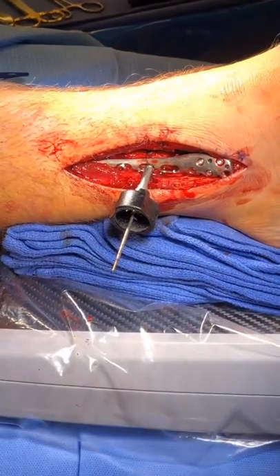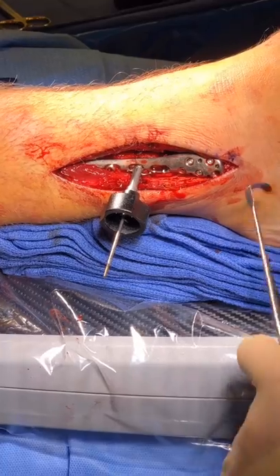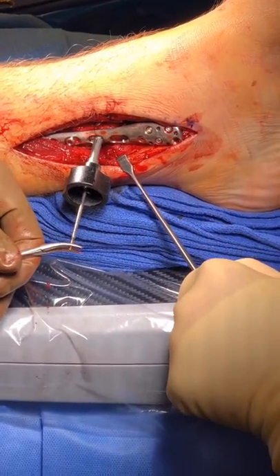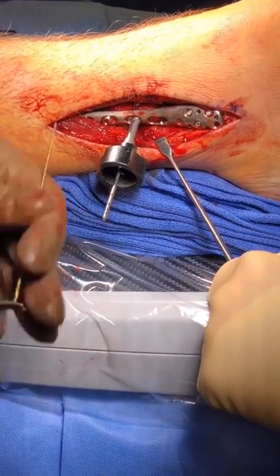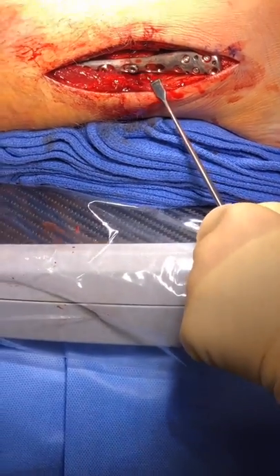And once we're content with that, we will take a hemostat and we will pull out the gold and then the silver. And that is it.